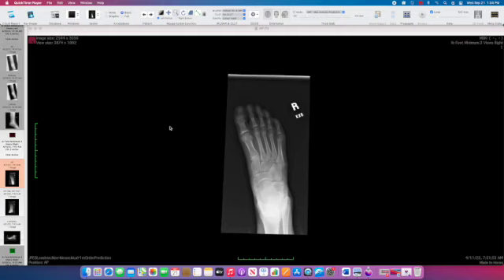This is case 8530. This is a 16-year-old boy with right foot pain. We have AP, oblique, and lateral radiographs of the right foot.